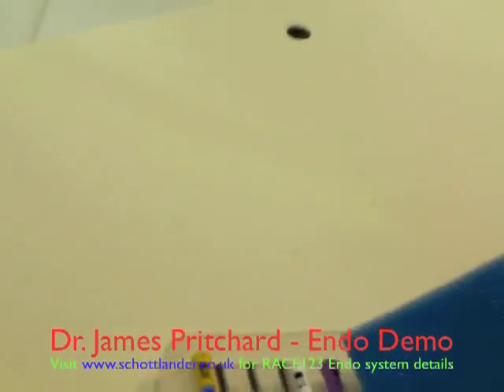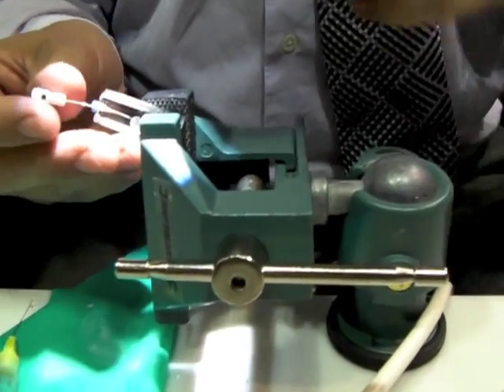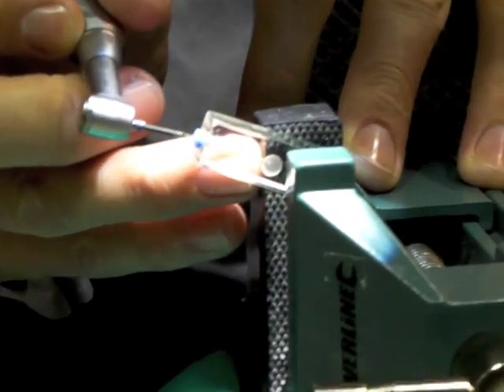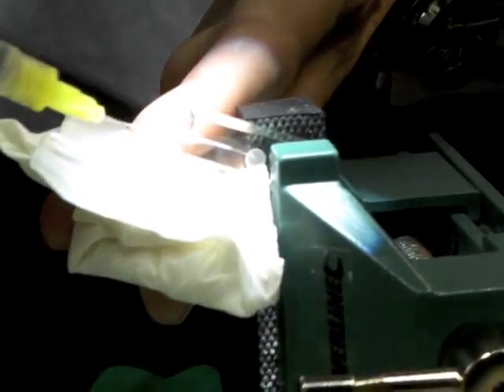The way in which we use these instruments is to establish a glide path to half the working length of the canal, or to the binding point, with a size 15 hand file. We then use the T1 instrument to do our initial coronal opening to our binding point, and then irrigate the root canal with sodium hypochlorite.